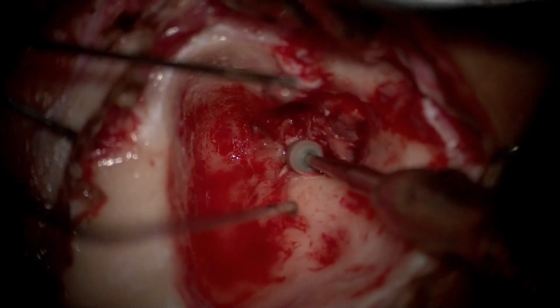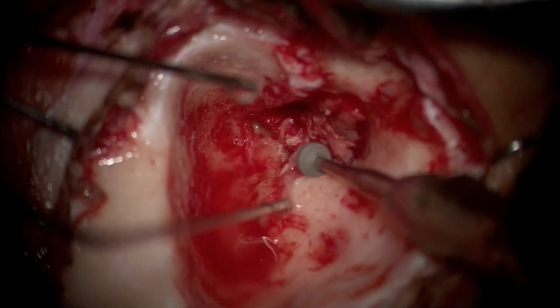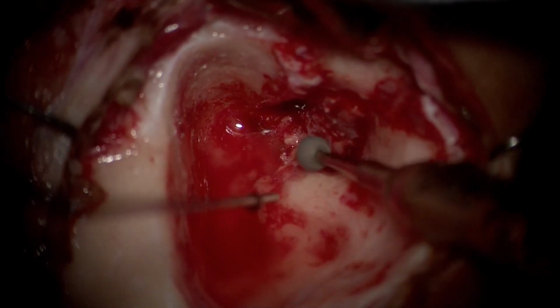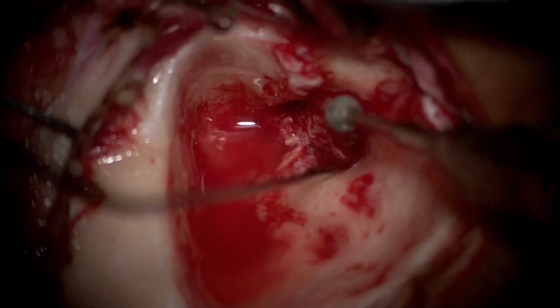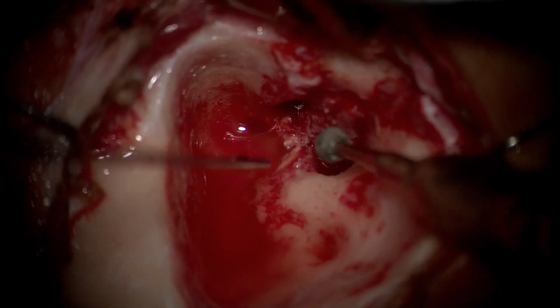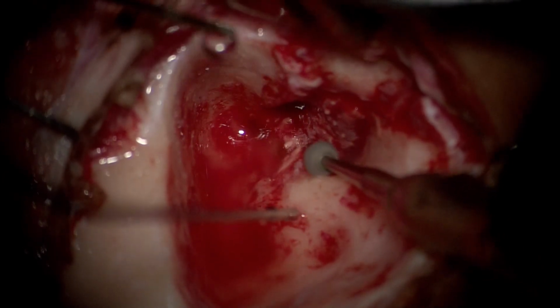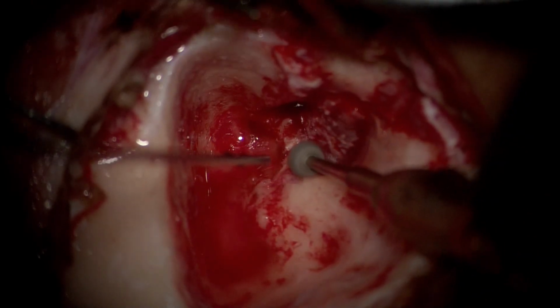Before one goes ahead, an appropriate sized diamond burr under ample irrigation must be used to lower the facial ridge as well as to thin it from the anterior portion, to be able to achieve an adequate view of the posterior mesotympanic recesses as much as possible. That way, one can be sure of not missing any epithelium inside this region, because if one does so, that is almost a sure shot recipe for having a recurrence.